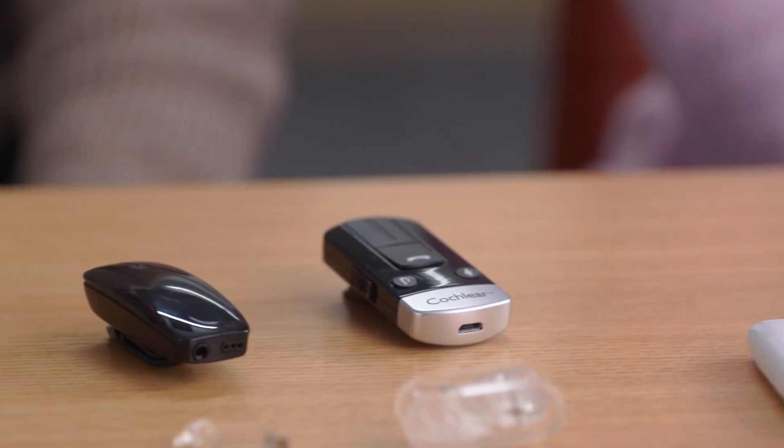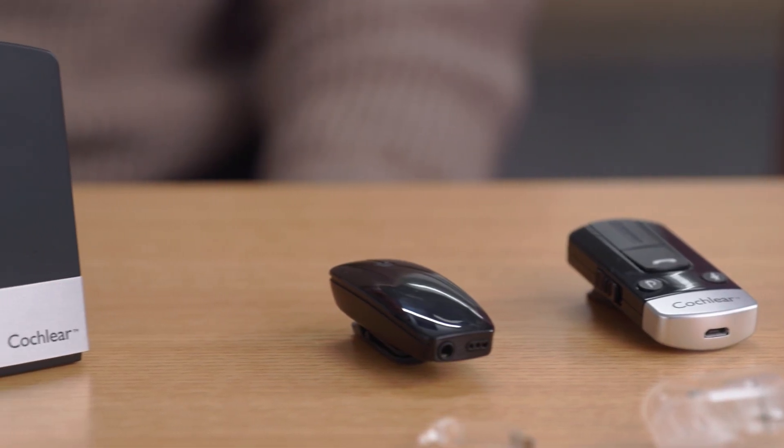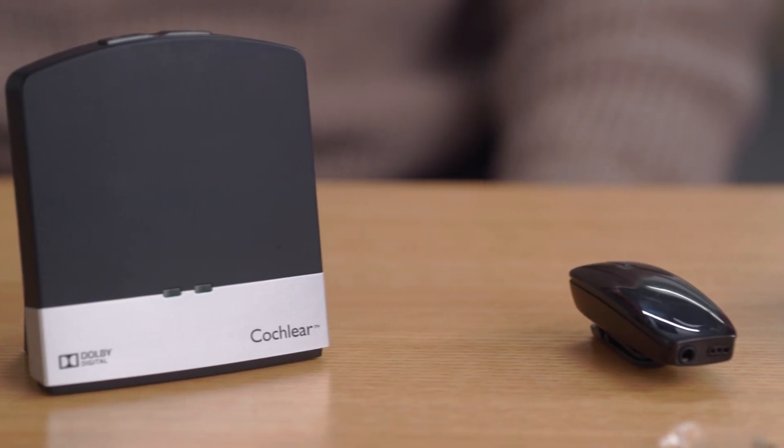Hi everyone, I'm Bethany, an audiologist and Cochlear employee. And I'm Greg, a bilateral cochlear implant recipient and I also work at Cochlear. Today we'd like to share with you what's included in the Cochlear Nucleus 8 sound processor kit. Whether you're a new recipient, have recently upgraded, or are just curious to learn more, this video is perfect for you.